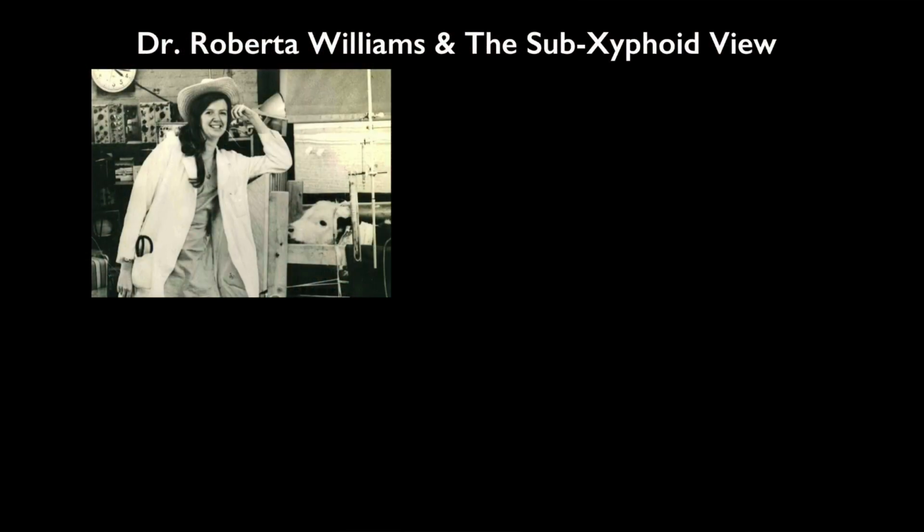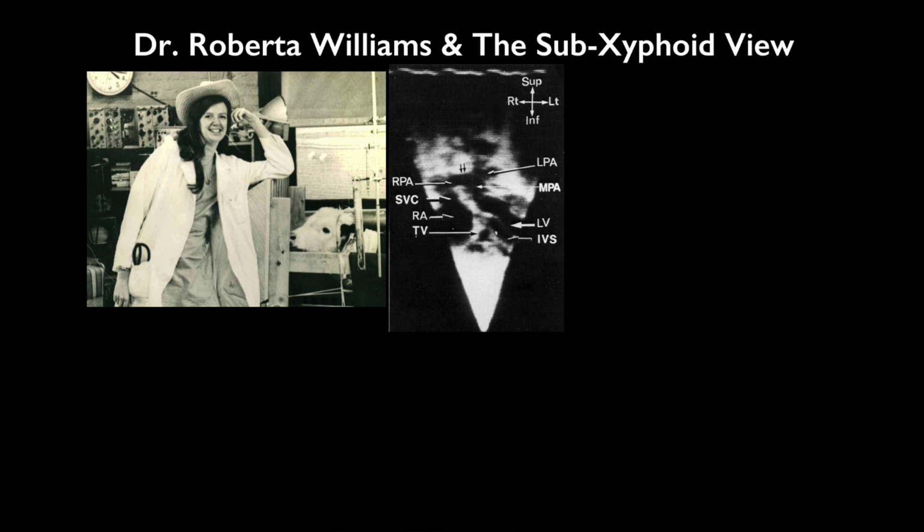And this I've taken from her original picture because I think it's important that we appreciate how ultrasound has advanced over the course that we have seen it in the last 50 years. Many of these early pictures needed labels because you were unable to recognize anything, and sometimes even diagrams. Now, Roberta did a remarkable thing. She decided to speak to one of the engineers about flipping the image into anatomic orientation, because we all read upright. If I put that title on upside down, it would have taken you much longer to recognize it.